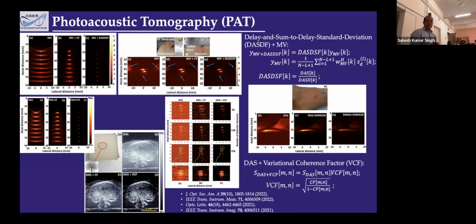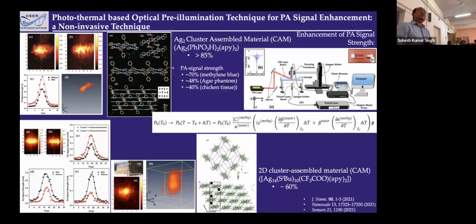So this one, we tried it for the volunteers, and over here, the potential for recovery of the blood vessel in the right side that we can see. Okay, yeah. And many phantoms we also tried. So this is about tomography, and then we tried it for chemistry applications.